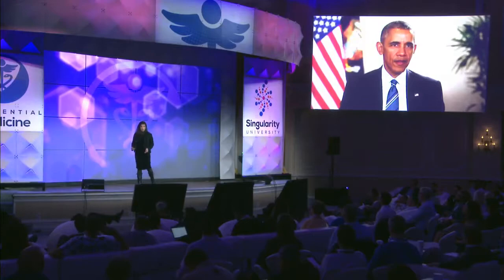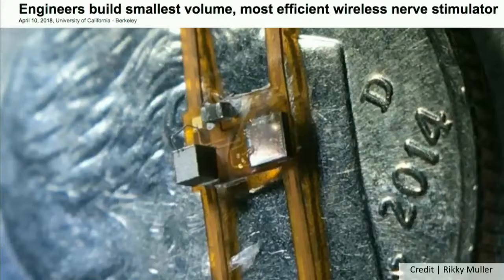So we're moving to a place where we can actually deploy brain-machine interfaces non-invasively. Take a look at another one. So this one's out of Berkeley, and it's called neural dust or stim dust. What you see there, and it's tiny, is a piezoelectric device. What these devices do is they take energy from one form and transmute it into another. So this particular device takes sound waves or pressure waves and turns them into electricity.